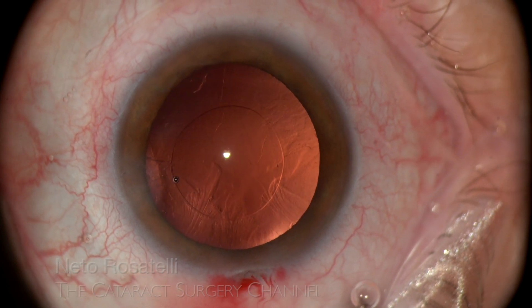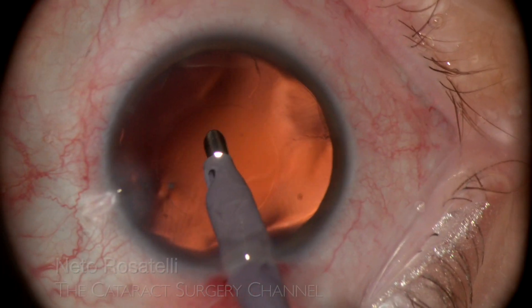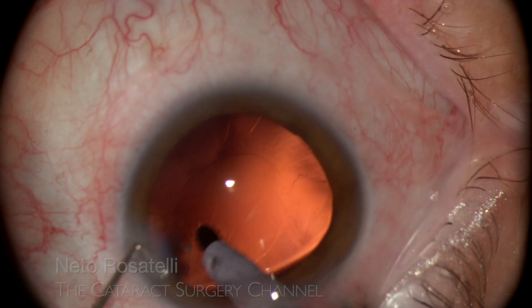After taking the phaco probe from the eye, I can see that there is a great amount of lens fibers still adhering to the posterior capsule. I go back to polish the capsule with my preferred method, using the phaco probe itself.